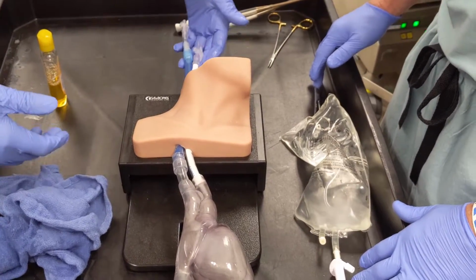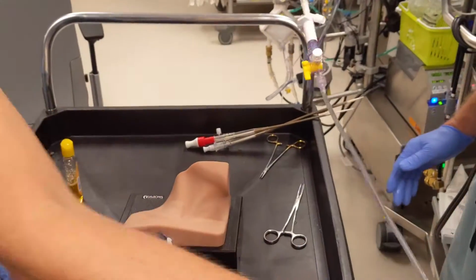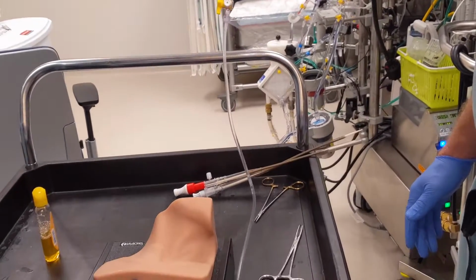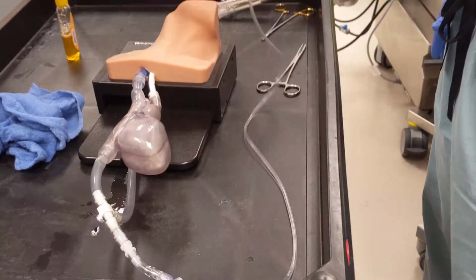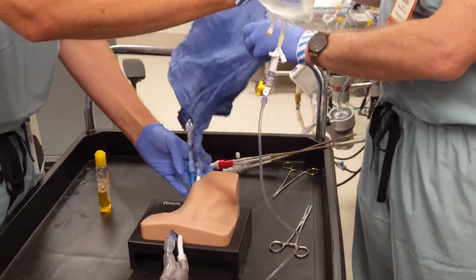Now we're ready to prime it. So we have 1 liter bag. This doesn't come with the kit. This is standard 1 liter bag connected to right here. And this is closed. You open it, and then you need to have these open, and then we'll prime it.